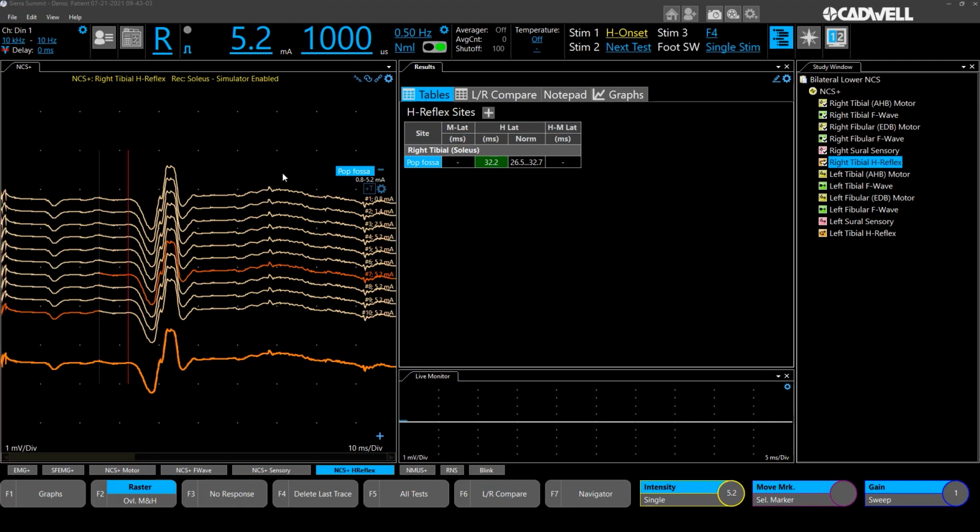This is the end of the NCS Plus tutorial. You can look for additional videos on advanced features and setup.